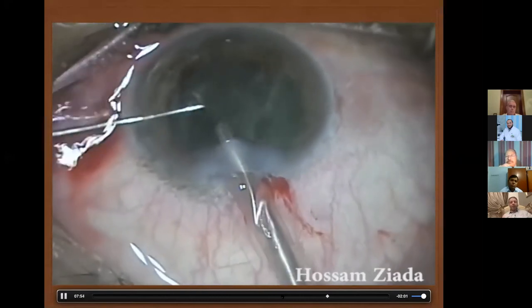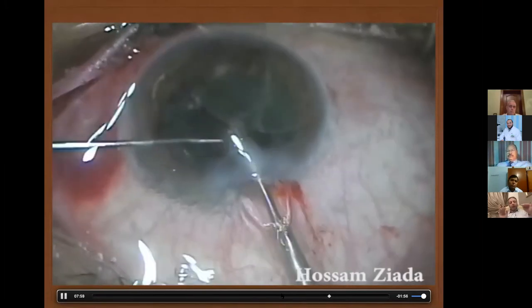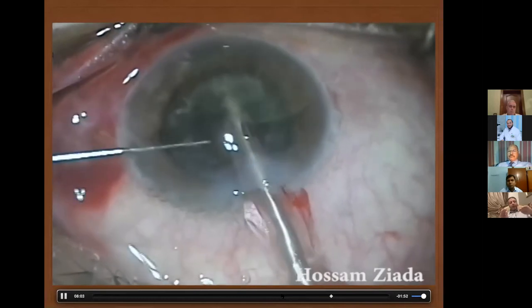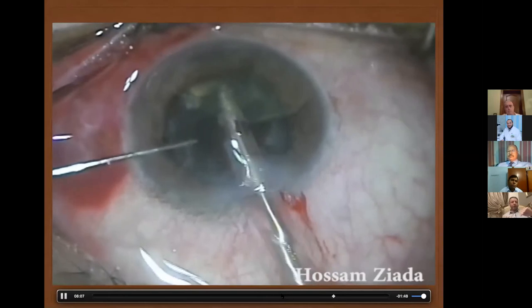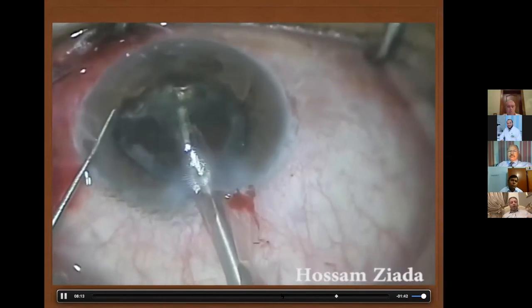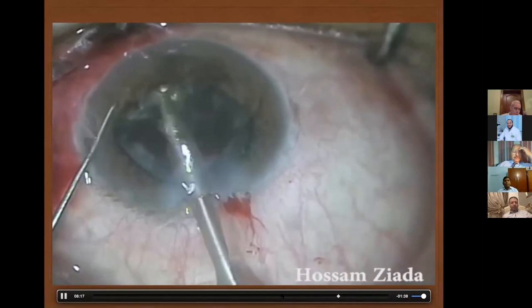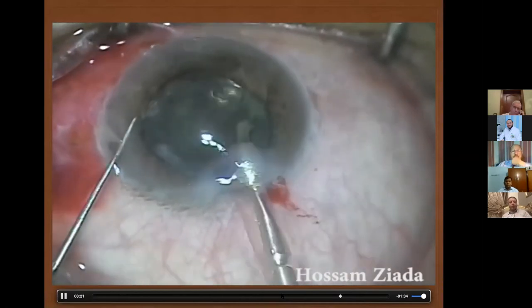I didn't like to push it, not to hit the endothelium, but I entered by the chamber to press the IOL back to get a depth or space behind it or below it. Then I tried to catch it from its posterior side and completed the phaco emulsification in the anterior chamber for this nucleus. What about the cortical matter remaining in the bag?